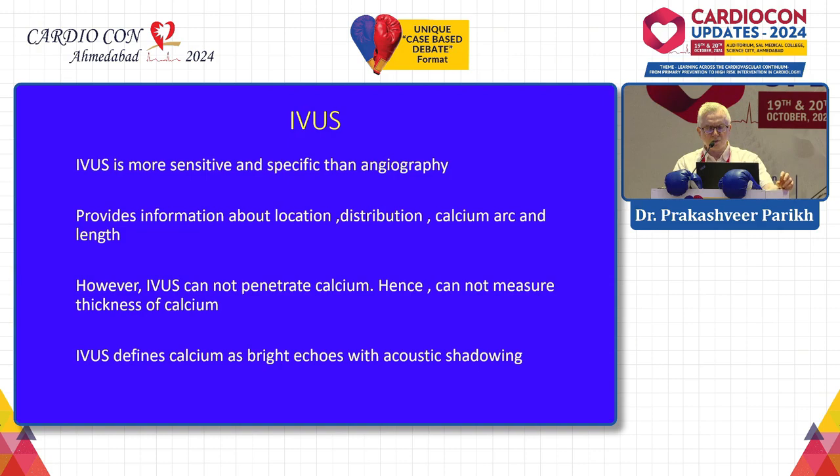IVUS is more sensitive and more specific than angiography. It provides information about the location, distribution, calcium arc, and the length. However, IVUS cannot penetrate the calcium. Hence, one cannot measure the thickness of the calcium. In IVUS, we typically see the calcium as bright echoes with acoustic shadowing.